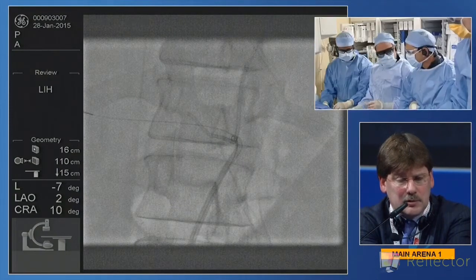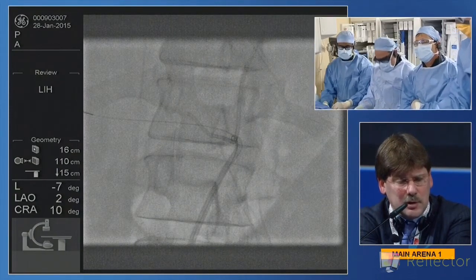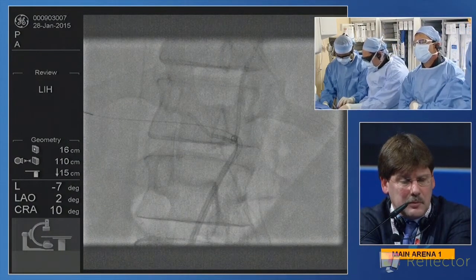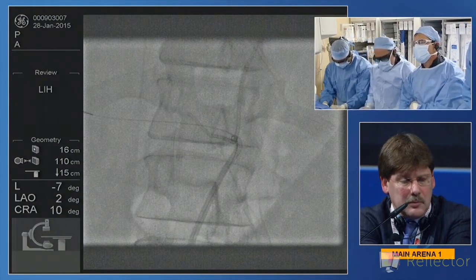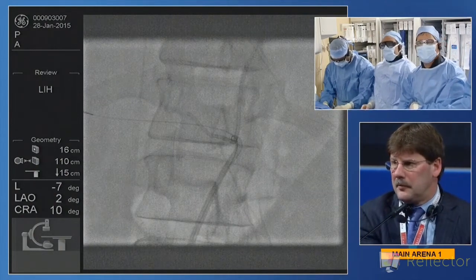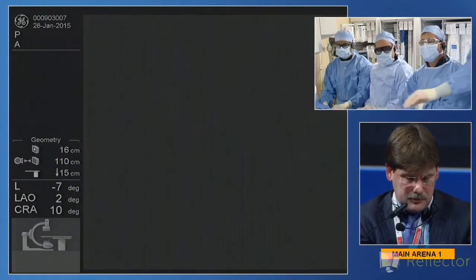And do you use detachable coils, and what size will you use? Yeah, we use detachable coils, and looking at this, we're going to probably want to start bigger and then go smaller. So we'll probably start with some 6s to 8s initially. We've got 6s pulled in off the nest.